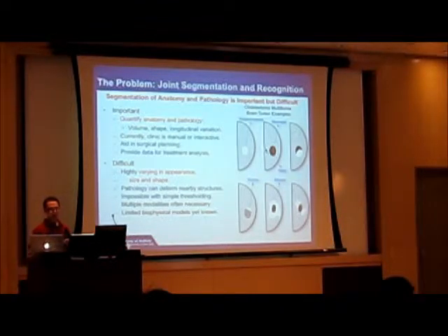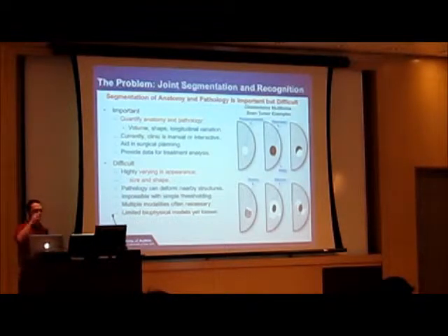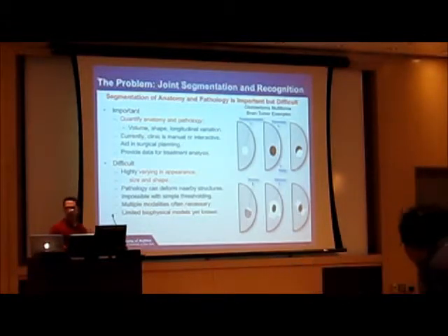However, the tumor grows so quickly that it kills itself, and so then you get dark in the middle of the tumor. Those are dead tumor cells with some enhancing rings. Then you have some variation on the outside, some debris, some vasculature, some veins and so on inside of the tumor. But also around the tumor you have edema, which tends to follow white matter tracts. If you're able to quantify the edema, then you'll have a good sense of the prognostic condition of the patient. Apparently the more swelling, the faster it's growing. So we'd like to get a good sense in this particular application of what's going on there.